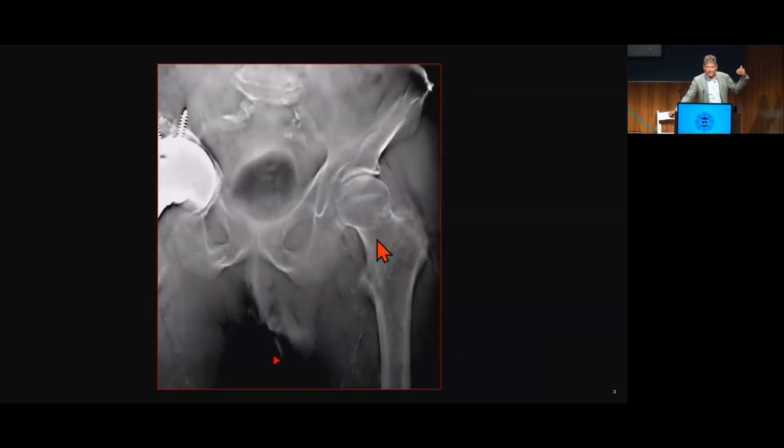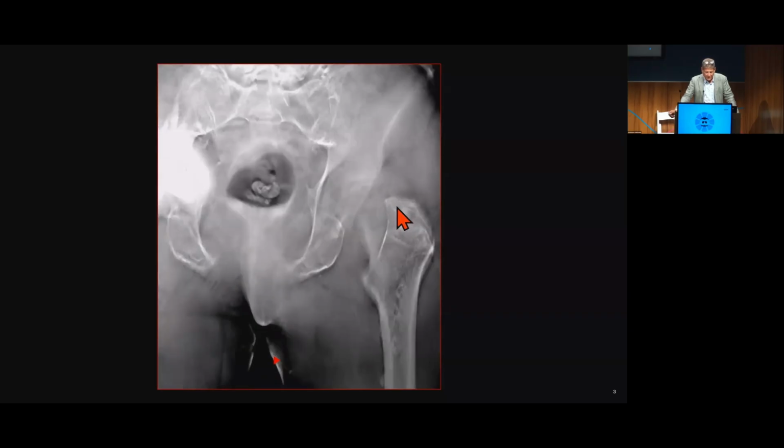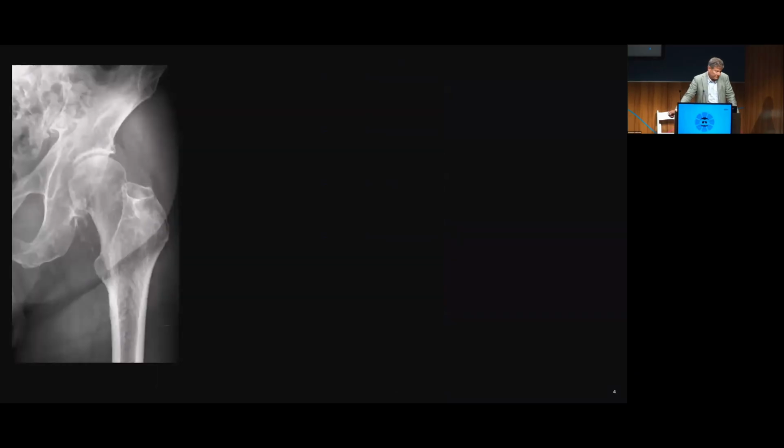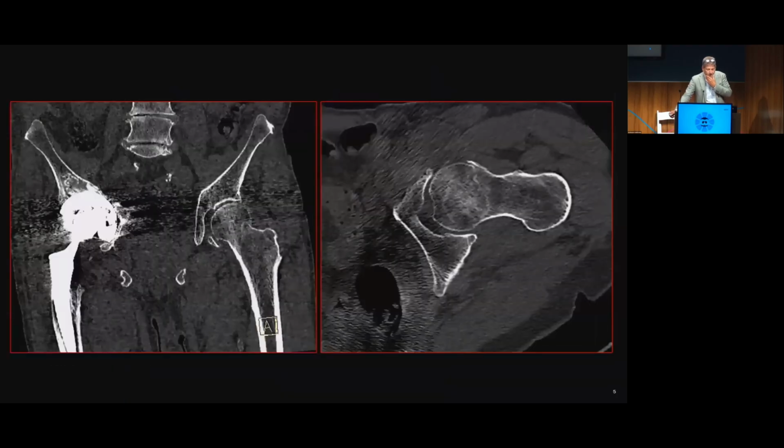You can see from this particular set the value of tomosynthesis. It's essentially a middle point between a planar X-ray and what you can see on a CT scan, and that's showing a fracture, albeit with many, many fewer images. In this particular case, you can see the fracture nicely compared to the X-ray, where you probably would need an AI algorithm to pick that out. You can see on the tomosynthesis images, it's really easy to see the fracture planes, and it really brings things into clarity.